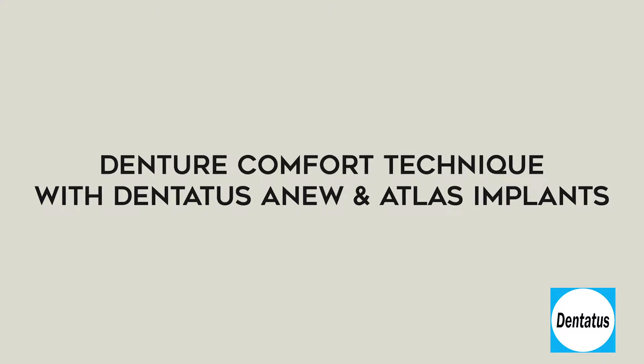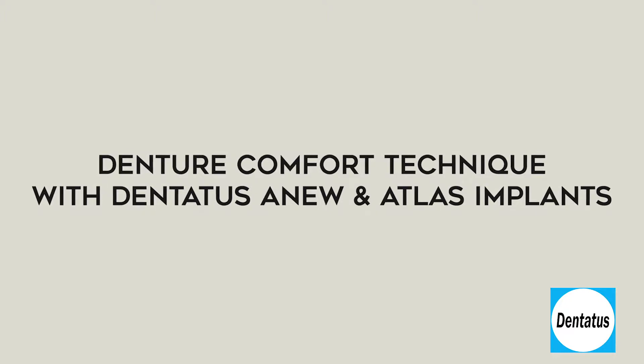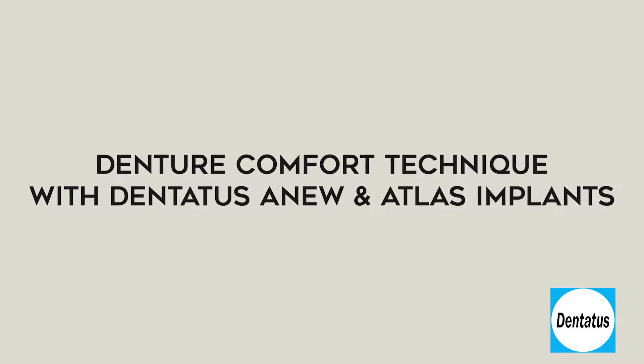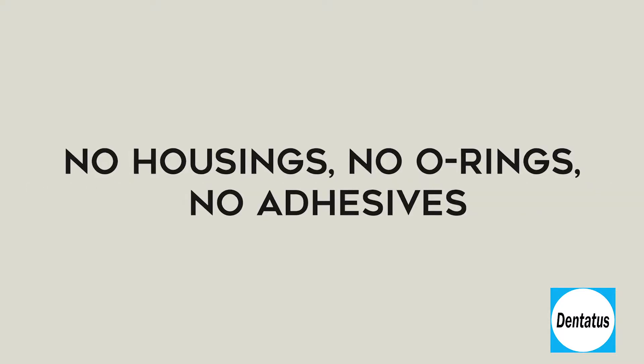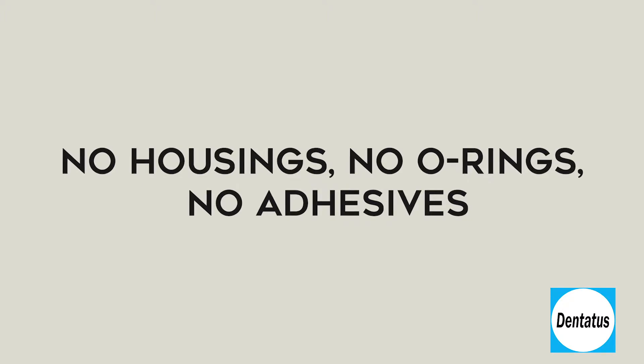This tutorial reviews the Denture Comfort technique, designed for both Dentatus Anew and Atlas implants. Denture Comfort is a simple and predictable technique and an ideal solution for patients with new or existing dentures. It's intended for long-term use to effectively retain and stabilize dentures, and it's the only system on the market today that eliminates typical hardware associated with overdentures — no o-rings, no housings, and no adhesives.